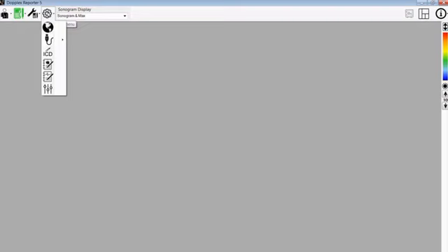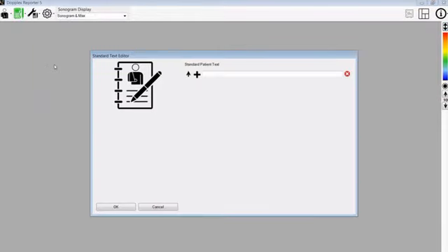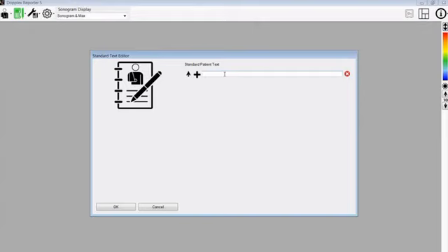Here we are going to show you how to edit the patient text. Go to the settings menu and then select the edit standard patient text icon. Here we have a blank box where you can add in free text to describe the patient's existing conditions. These text boxes can contain a large sentence or a few words to describe the patient's conditions.